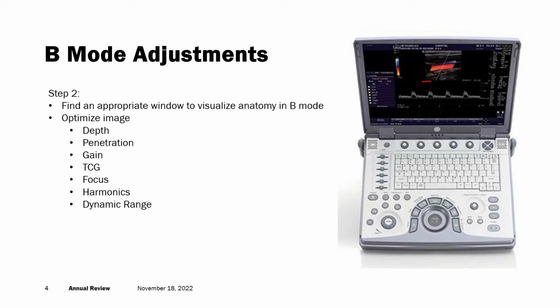Each of our transducers that you will have available to you, you will be able to set penetration somewhere between what's listed on the transducer. So on the side of most transducers, you'll see something like, for instance, on a curvilinear transducer, it's probably printed 2 to 5. And that would indicate that you could operate that transducer at 2 megahertz to 5 megahertz.